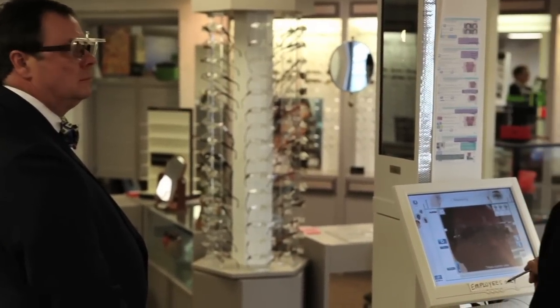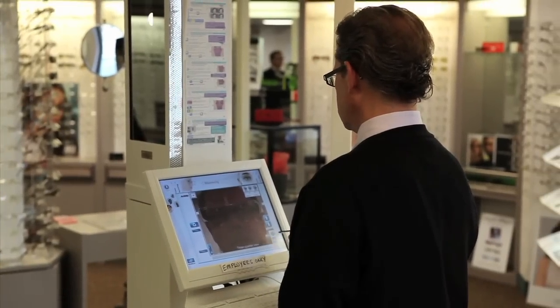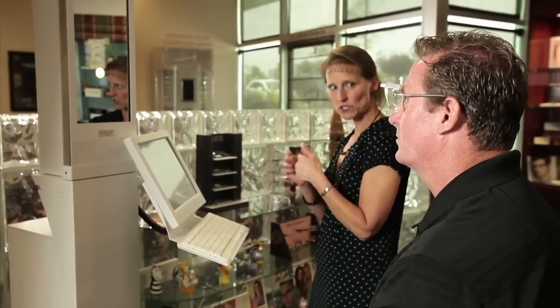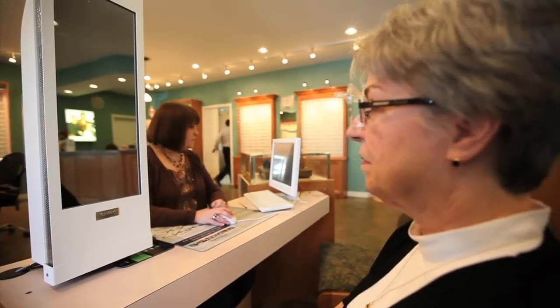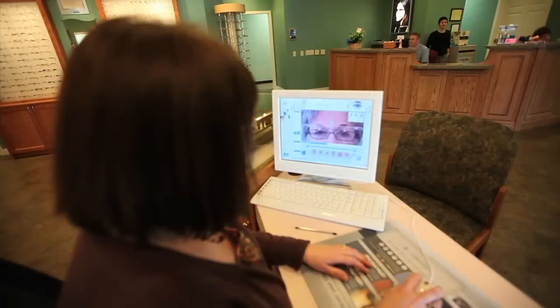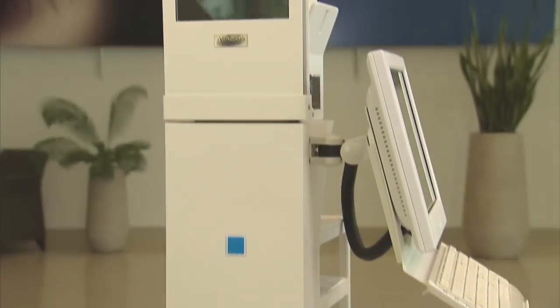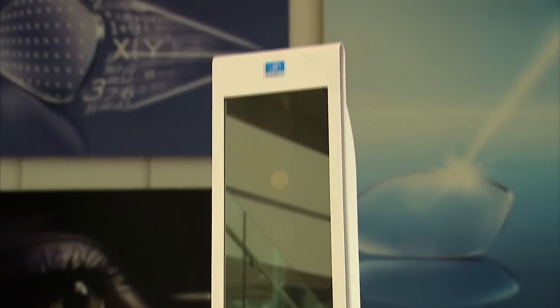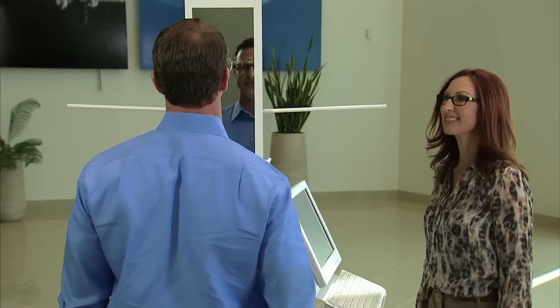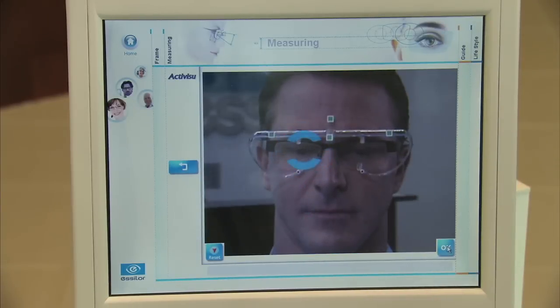Independent eye care professionals with the VisiOffice system have shown increases in practice financial performance and patient satisfaction and retention. The educational tools and precise measurements allow the ECP to improve the practice's mix of more premium designs and no-glare lenses, while having access to a portfolio of personalized lenses allows VisiOffice ECPs to provide a truly personalized visual solution for every patient. Overall, the VisiOffice system allows the eye care professional to offer comprehensive patient care from exam room to dispensary, and distinguish their practice from competition through unique patient experiences and exclusive personalized visual solutions.